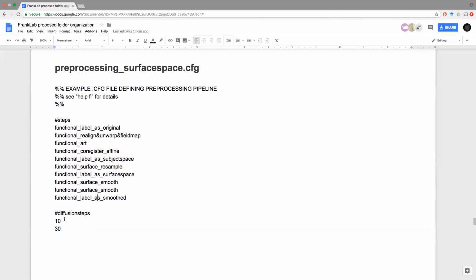Okay, but the point of this is basically to have 3 versions of your functional data: one that hasn't been smoothed at all, and then 2 versions that have been smoothed to different levels. Just this idea of doing 2 smoothing levels is sort of like a lab idiosyncrasy, right? Yeah. You could just do one well-informed level.